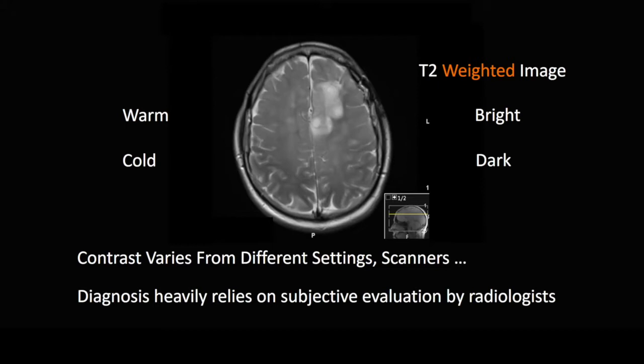Because this contrast is relative, we are not able to get any numbers from this image, so the diagnosis currently still heavily relies on subjective evaluation by radiologists. This also causes a large challenge in making this MR scan standardized, because it's really hard to control the contrast across different vendors and different sites.